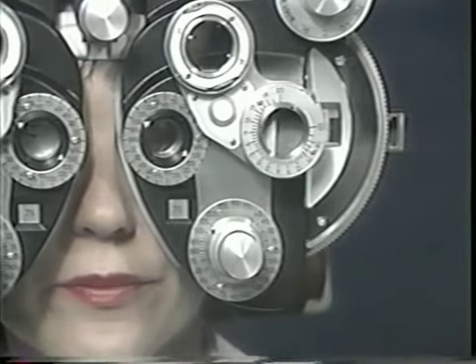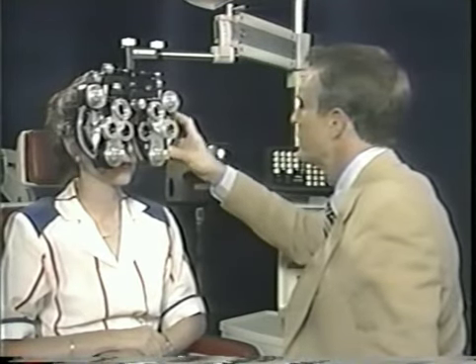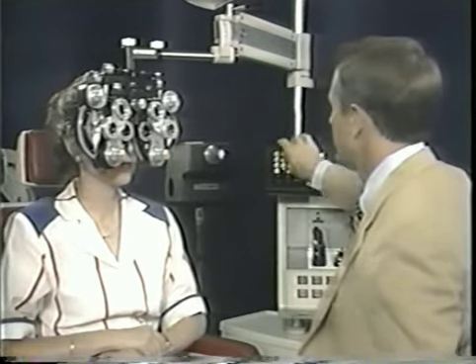OHPNTZ. Very good. Some refractionists use the red-green or duochrome test to refine the final sphere. The patient should be a little fogged by adding a little plus sphere power to about the 20/25 vision level before introducing the test, for the red-green target provides poor control of accommodation. With the patient slightly fogged, the red side should appear in better focus than the green side, for the red rays focus farther back toward the retina than the green rays.